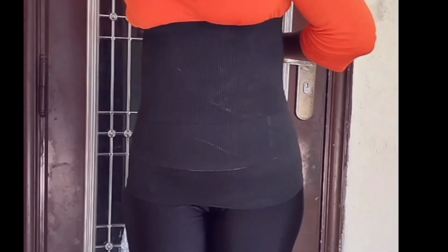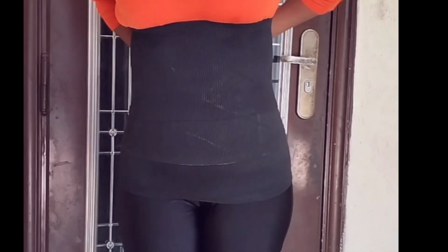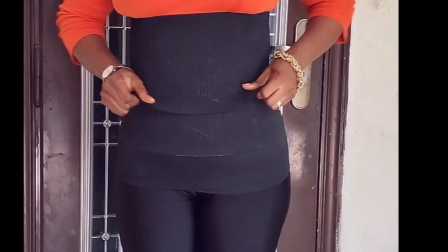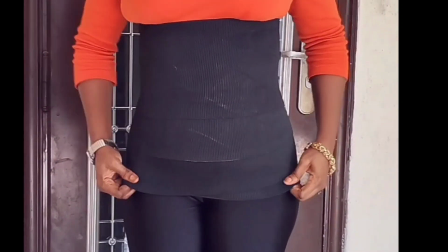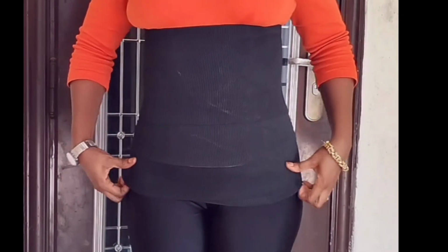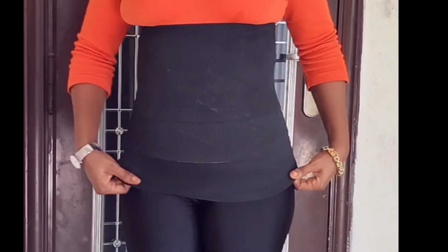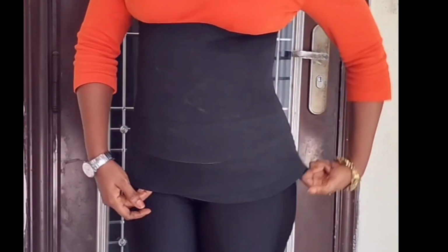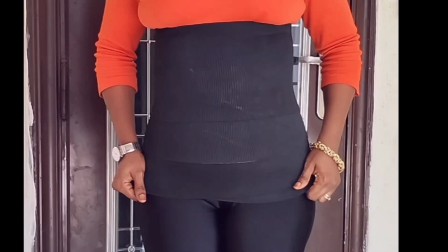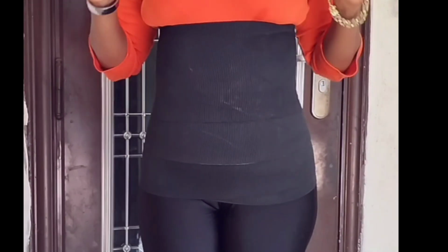In fact, I think hospitals should start selling this. You know, you just wrap it simple like this. Make sure there's enough space. Don't make it too tight. From time to time, you can keep tightening it as the tummy goes down, okay? But it must never be too tight that there will be no room for you to put your fingers inside. So it's very easy, it's very useful, it's not dangerous at all.